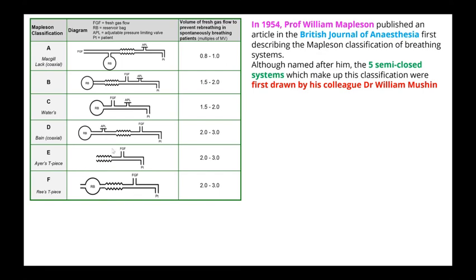So to avoid this problem of inability to monitor the patient's respiration, Jackson Rees, who was an assistant to Ayre, introduced the reservoir bag. When you see this picture of the reservoir bag, can you find anything different from the reservoir bags in the previous pictures here? It's open. It has a tail which is open. Whereas all these bags are fully closed. They are not open anywhere.